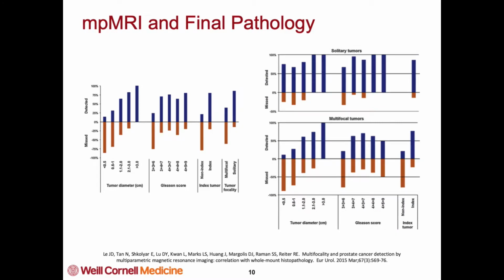If you look at MRI with final pathology, Rob Ryder's group showed this in about 122 patients who had a preoperative MRI and then a subsequent prostatectomy. There were 283 foci of prostate cancer, highlighting the fact that prostate cancer is a multifocal disease, but the majority of prostate cancer that was seen was greater than Gleason 6.